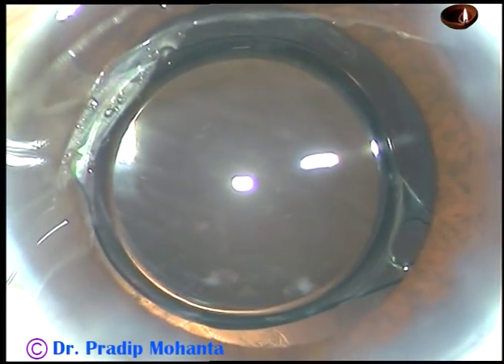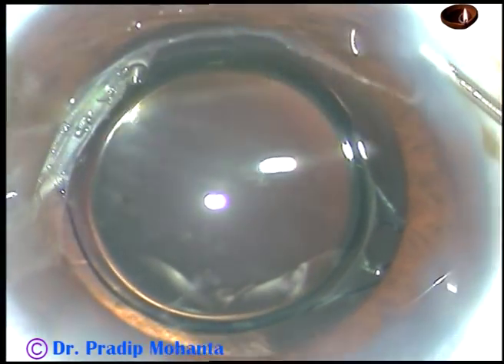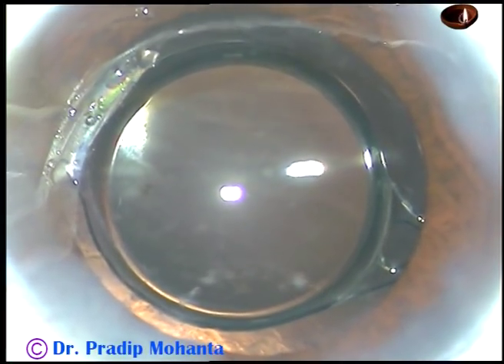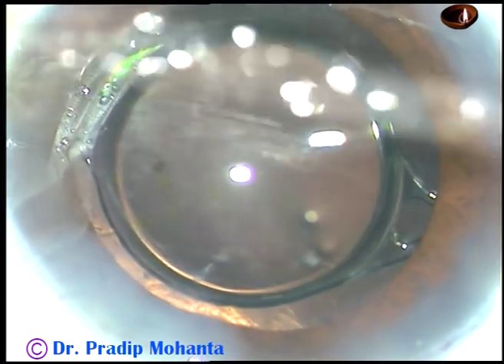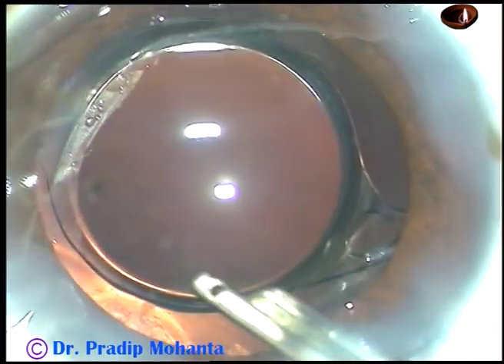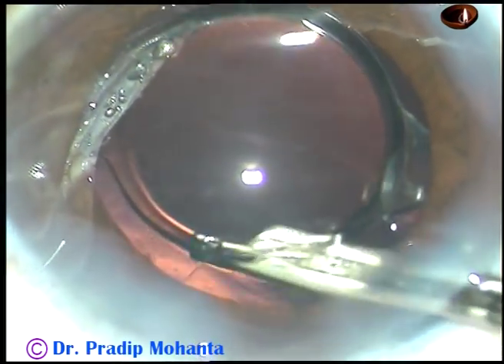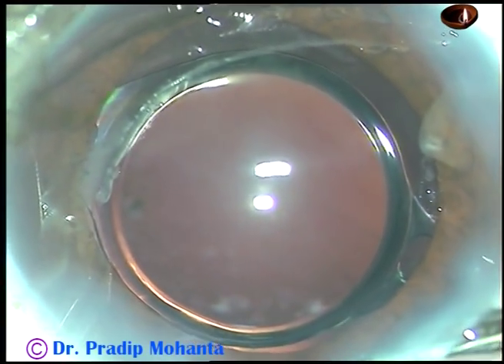The case is done. I just have to hydrate the side ports so that these wounds close and form the anterior chamber. Thank you very much for watching. I hope this video will inspire you to do two-stage rhexis even when the cataract is pre-intumescent — when you see that the cataract is white with a lot of convexity of the anterior capsule, two-stage rhexis helps in such cases.